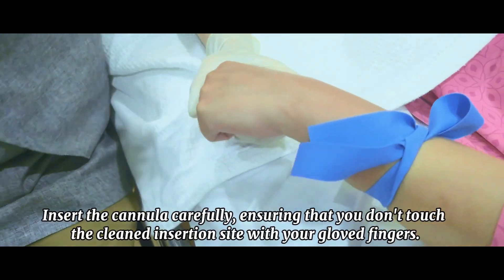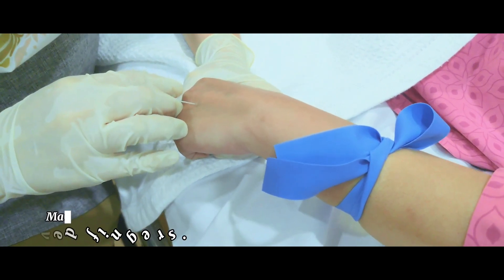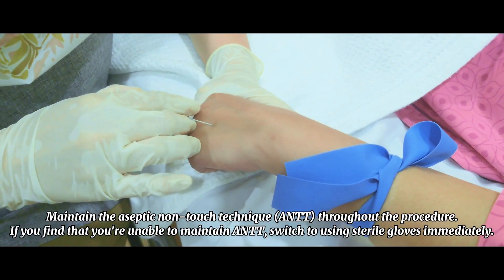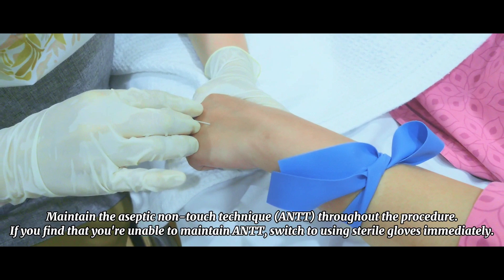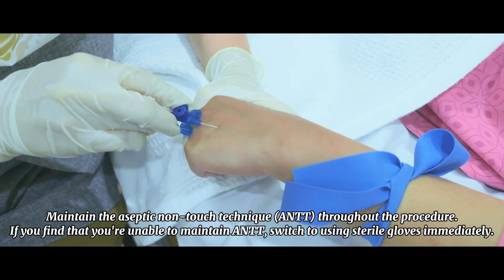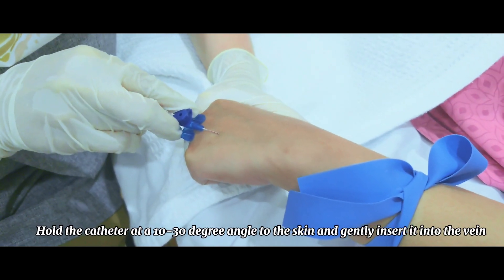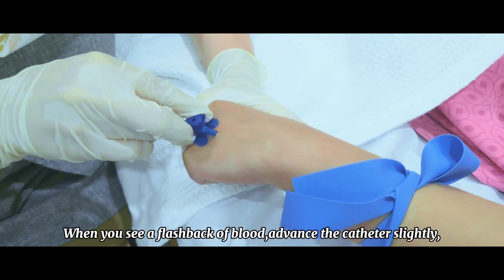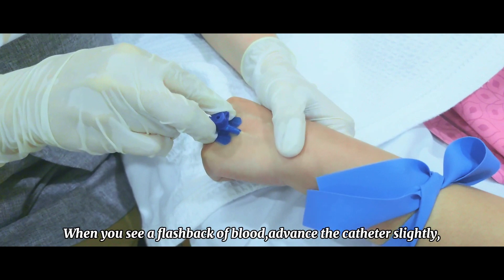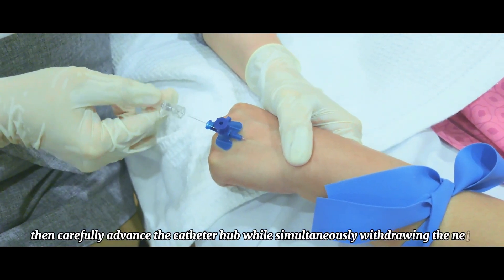Insert the cannula carefully, ensuring that you don't touch the clean insertion site with your gloved fingers. Maintain aseptic non-touch technique (ANTT) throughout the procedure. If you are unable to maintain ANTT, switch to sterile gloves immediately. Hold the catheter at a 10 to 30 degree angle to the skin and gently insert it into the vein. When you see a flashback of blood, advance the catheter slightly, then carefully advance the catheter hub while simultaneously withdrawing the needle.